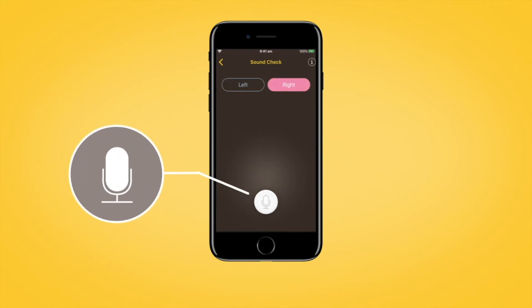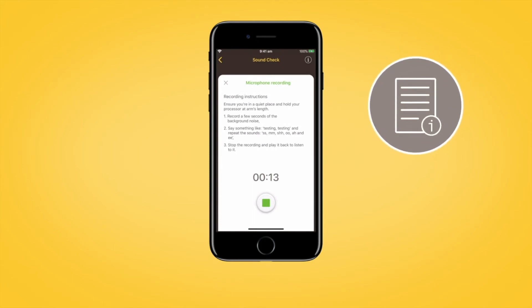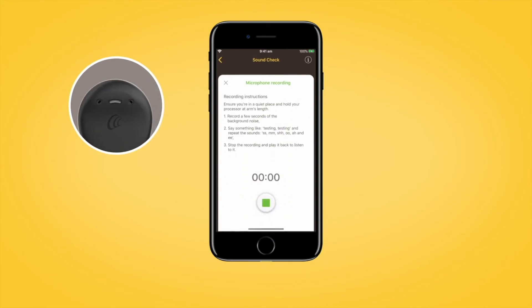Then, when you have selected the sound processor you want to test, tap the Start Recording button to begin recording sound from your sound processor microphones. There are in-app recording instructions and sound assessment tips to help you obtain a good quality recording. The recipient will hear an ascending tone sequence at the start of recording, and while recording, the sound processor light will display steady blue.